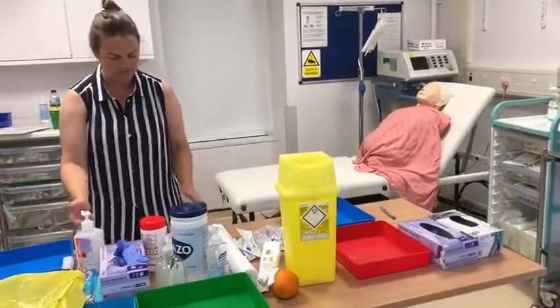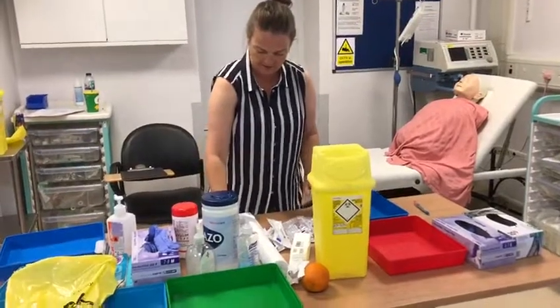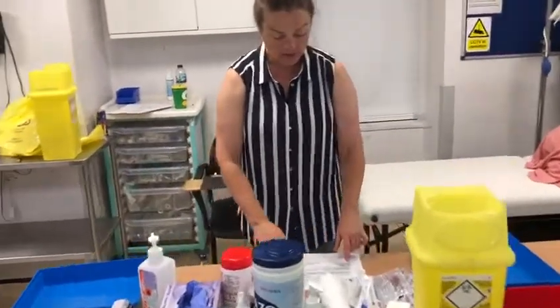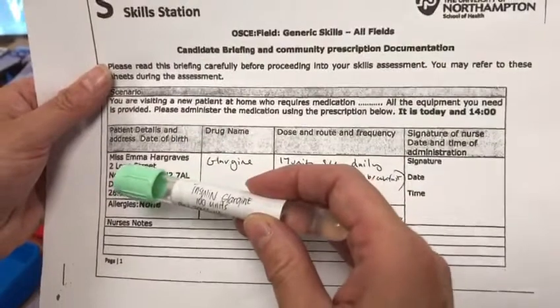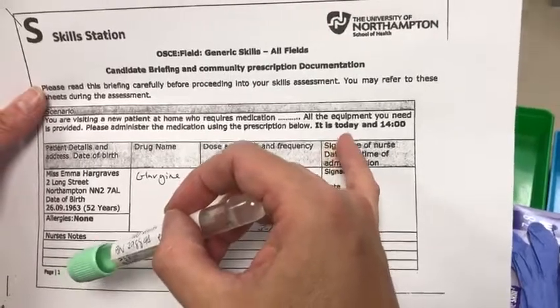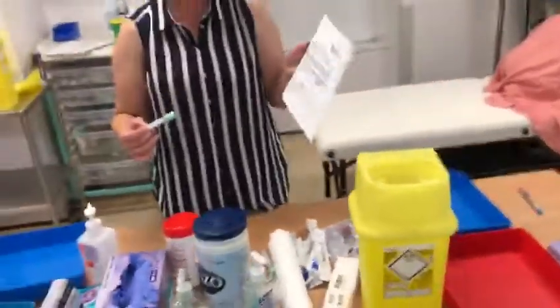So I'll re-wash my hands because I've left the patient. She's got her insulin here. I'm going to check my prescription first — it's all correct. I'll do the rights of medication administration. So I've done an ID check: Emma Hargreaves, right patient. I've got the right drug — Glargine. She wants 17 units, subcut, given daily after breakfast. It is signed by a doctor and says to be given today at this time. I'm quite happy this prescription is correct and legal.